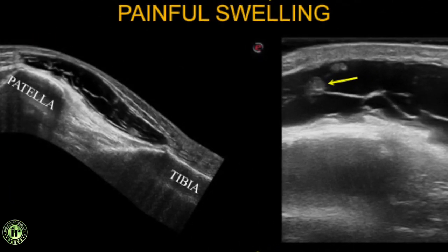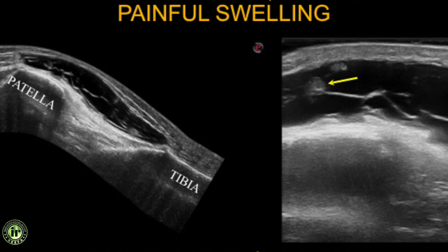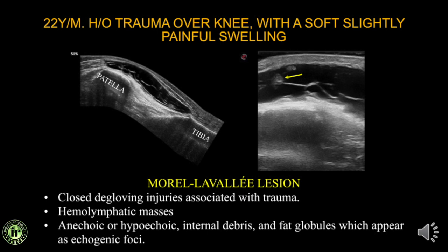A 22-year-old with history of trauma over the knee joint presented with a slightly painful soft tissue swelling. Extended field of view ultrasound beautifully demonstrated the lesion extending from the patella to the level of the tibia, with multiple internal septations. The clinching finding was fat globules floating inside the swelling. This was a Morel-Lavallée lesion — a hemolymphatic mass that develops in closed degloving injuries. It is often anechoic or hypoechoic with internal debris, septations, and echogenic fat globules.